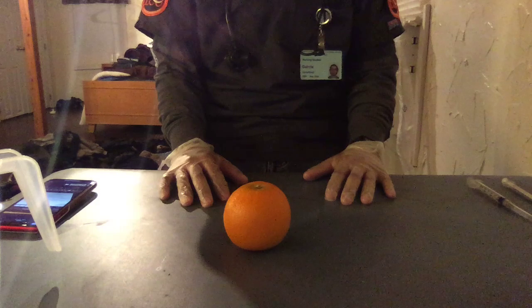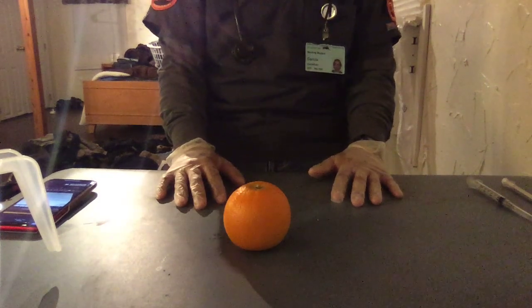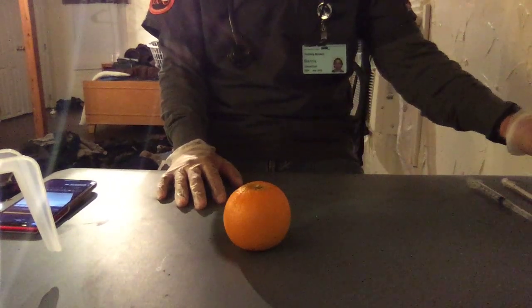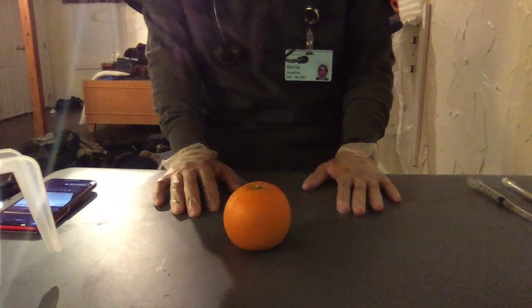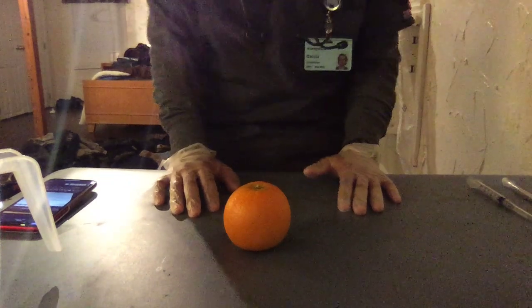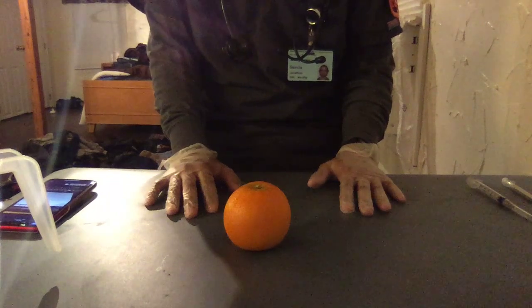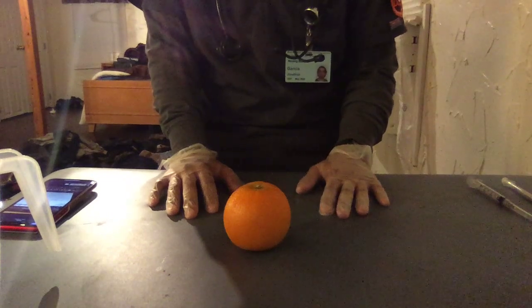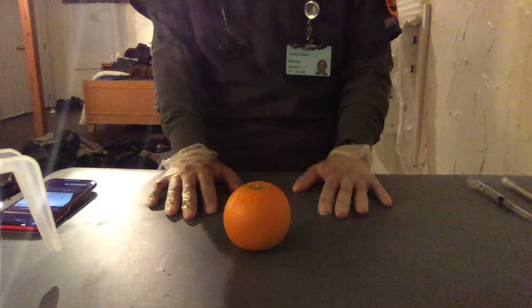Patient name is Sally Smith. Date of birth is 6/8/55. And I have 3 injections I have to give her. So the first one, I'll get my MAR, read the physician's orders. The first one is 1.5 milliliters of saline intramuscularly one time now, and 0.5 milliliters of saline subq one time now. And the last one is 0.3 milliliters of saline intradermally, ID, stat.